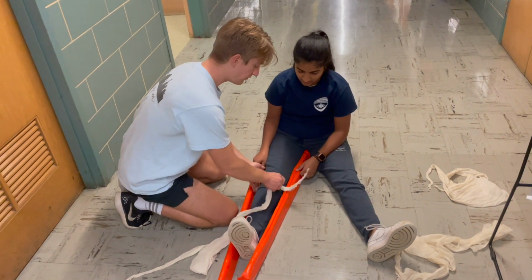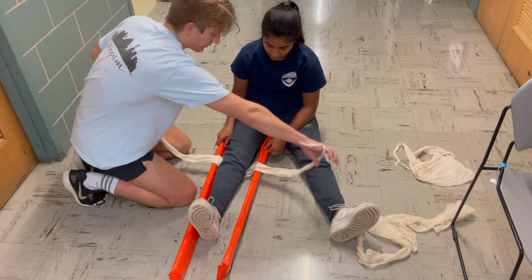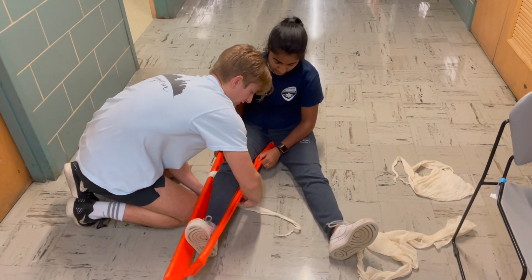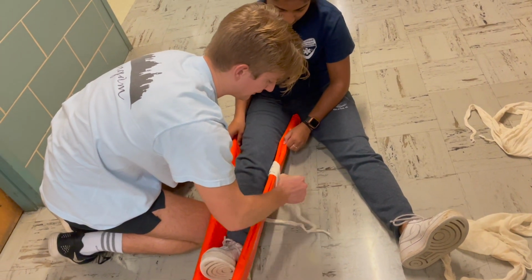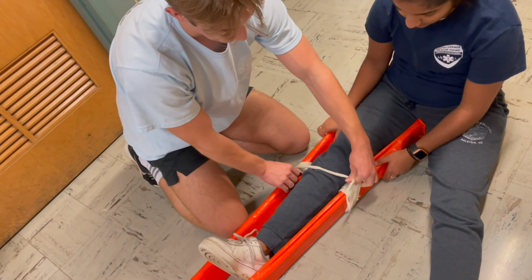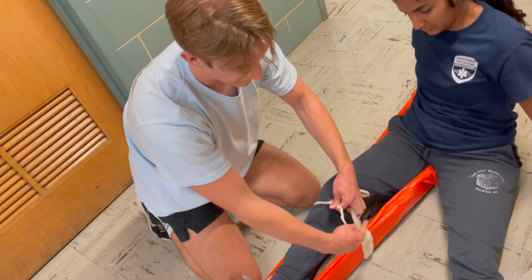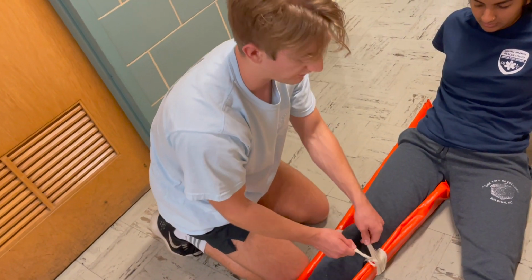For the saddle, I'm going to first go under the patient's leg, and then I'm going to wrap around the boards completely. So I went under the leg and then above the boards, so it's kind of like the leg is laying in a hammock within the boards, and then I'm going to go all the way around like this. So you can see that her leg is kind of supported by this hammock down here, and then otherwise the dressing is going all the way around the boards.